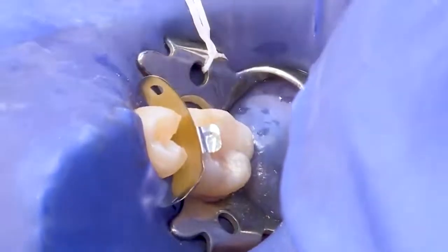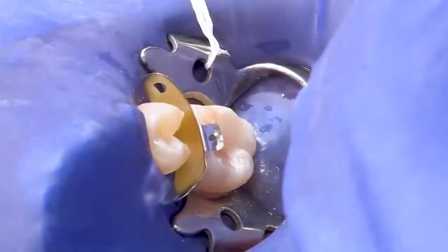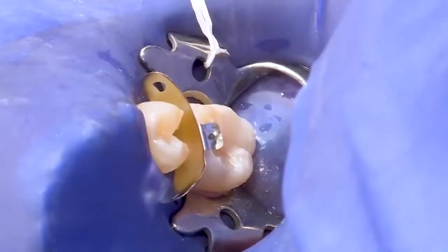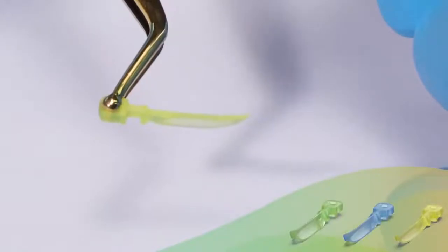Using the pin tweezers, grip the sectional matrix tab and bend as needed. Place in the interproximal region with the concave surface facing the tooth being restored. Place wedge that best adapts matrix to the gingival portion of the preparation.